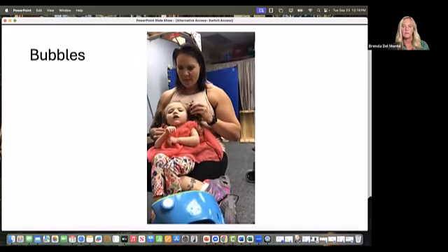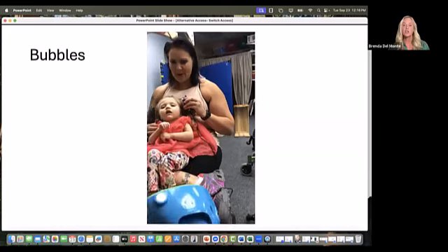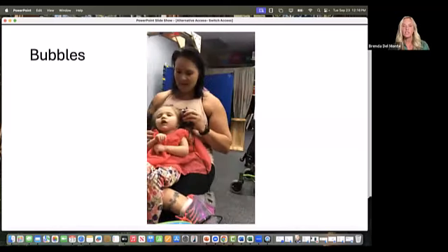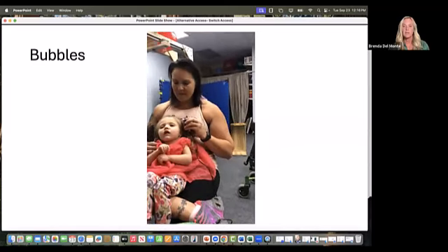Notice she's not chasing her head. She's not putting the switch lightly on her head. She's not moving the placement.